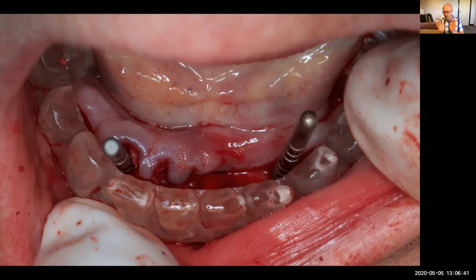and then the implants are placed. And it's a surgeon that does that. It's a surgeon that does the scanning. But Rowan and I, that's my technician, we participate in the positioning of the implants. We make sure that we actually get surgical guides done beforehand, which are copies of the denture. And then when the implants are being placed, we make sure that the implants are positioned so that we can make dentures over the top that will work really well and also look good.